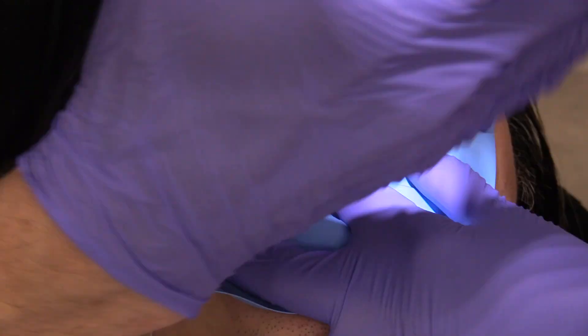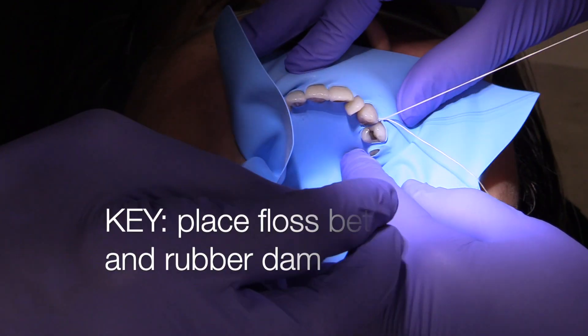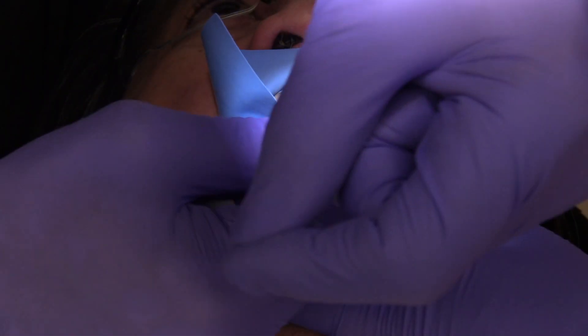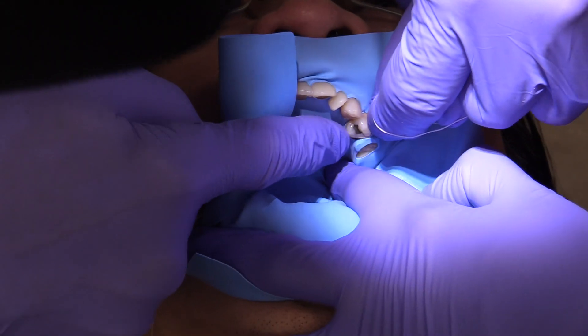You can see that I'm using the dental floss by placing it between the tooth and the rubber dam first in order to get the leading edge of the rubber dam below the contact area. I never try to take the entire mass of interproximal rubber dam and push it through.